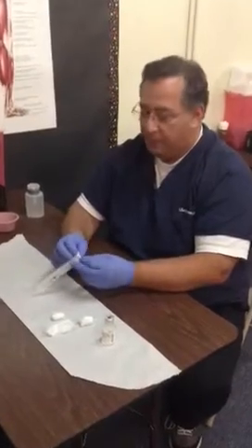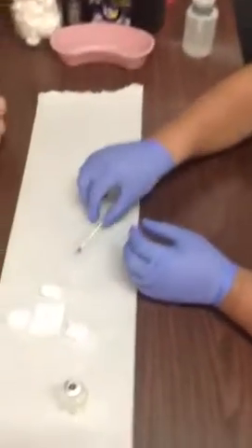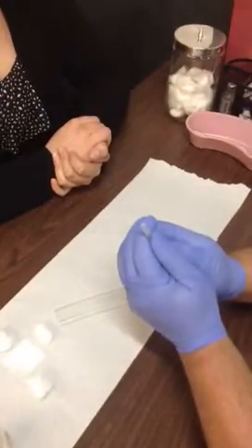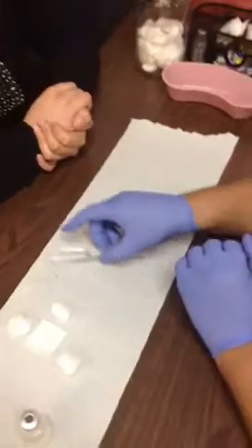The first thing I'm going to do is prep my syringe — take that back half off and throw it in the trash, loosen the plunger just like before, and then we're going to loosen the cap by pushing it forward. Don't take it off, just loosen it and set it back into its sterile field.